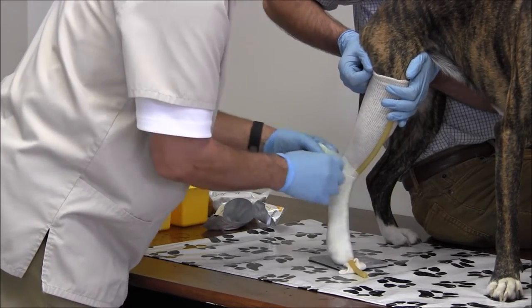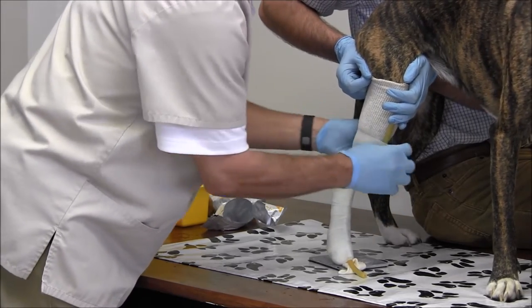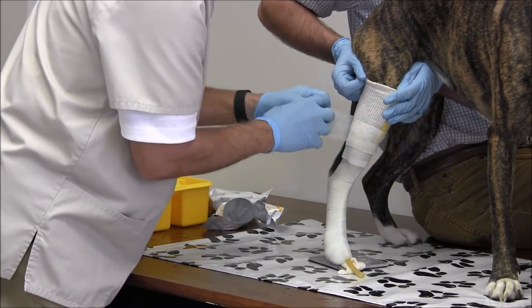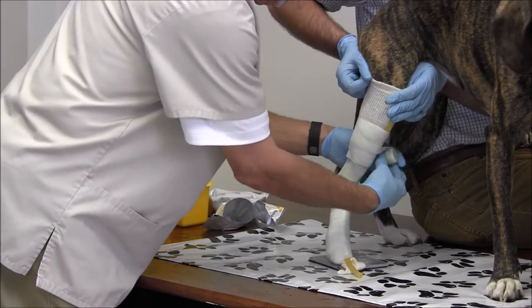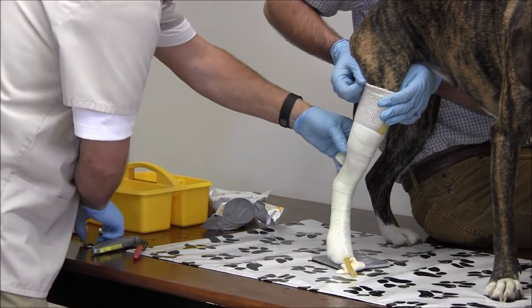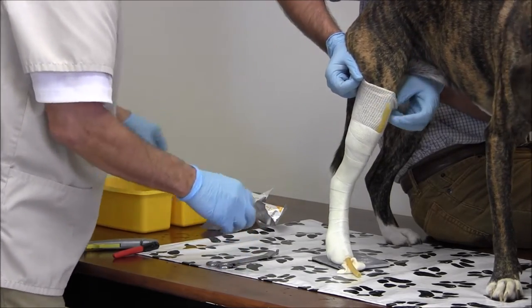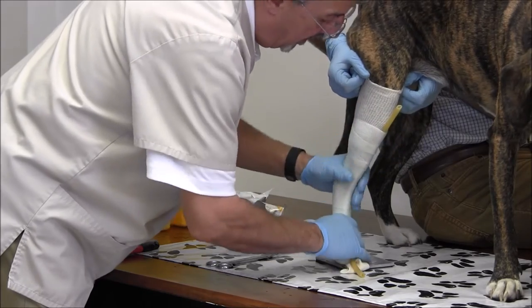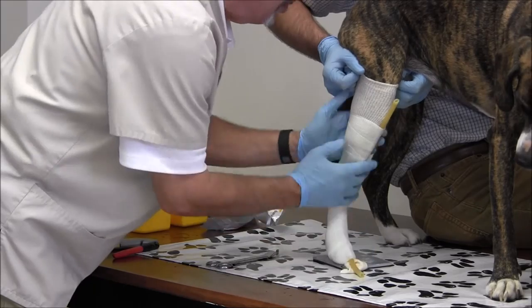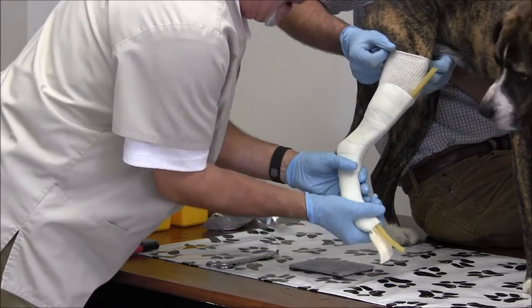We want to make sure that we get around the Achilles tendon, and we're going to wrap just below the stifle — that will be the height that we need. Any excess fiberglass, go ahead and cut it off so the cast is not too thick. Now we've got the fiberglass wrapped around the leg. We want to massage it in nicely, which will bring all the fibers together.